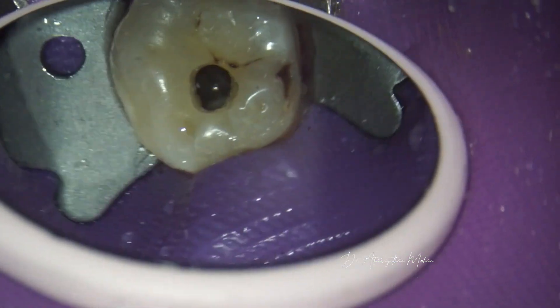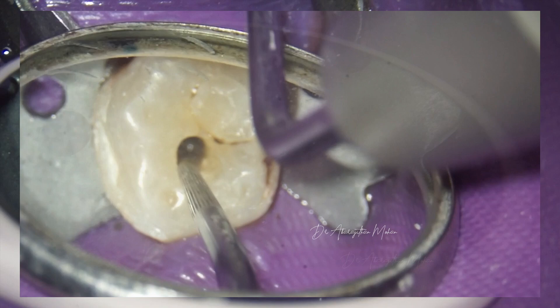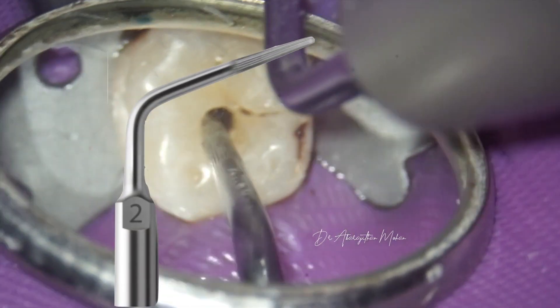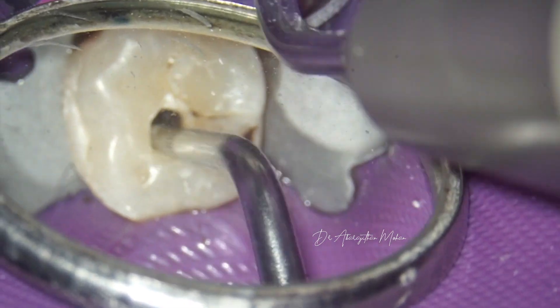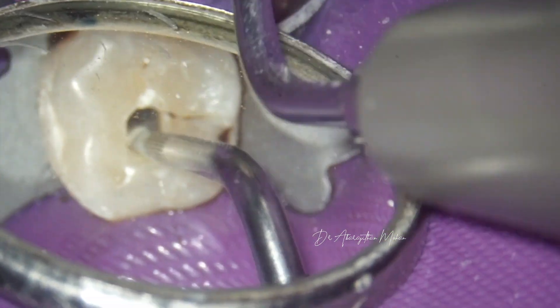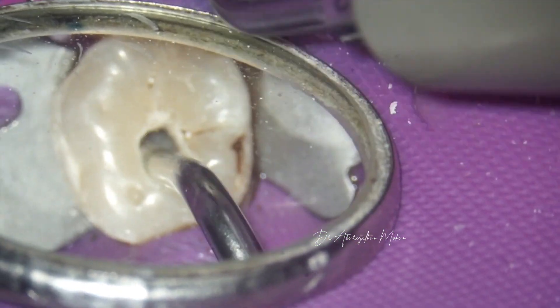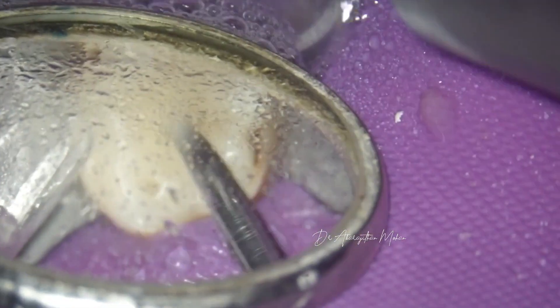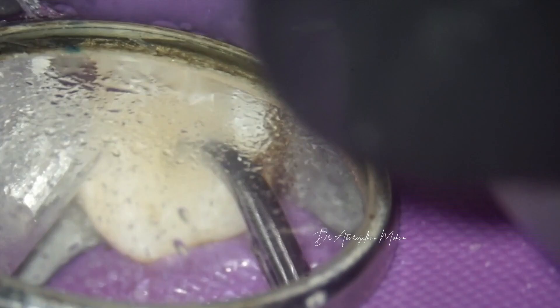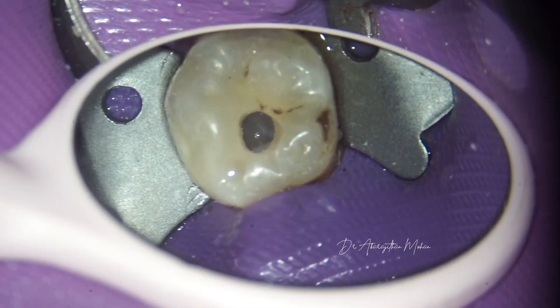Following use of slow-speed burs, we always clear the debris with a conventional scaler, and then further access refinement is done with ultrasonics. The Startex is used in dry mode here. Use of diamond burs for refinement of access can actually widen your access cavity, so following use of the Startex in dry mode, the regular conventional scaler is used again to clear the debris.